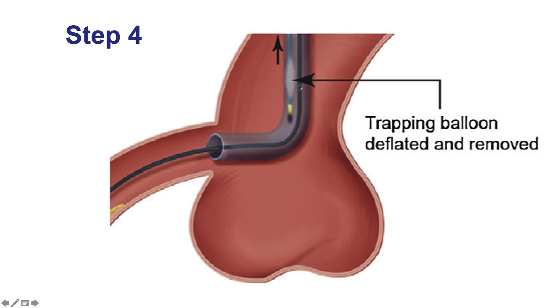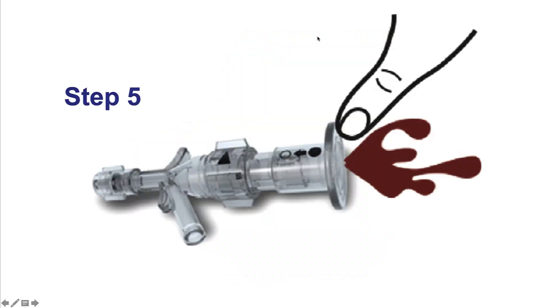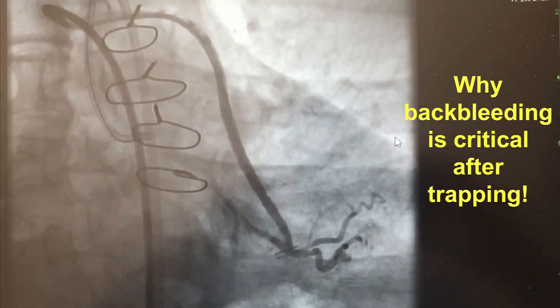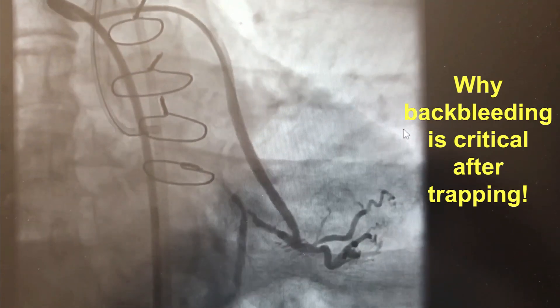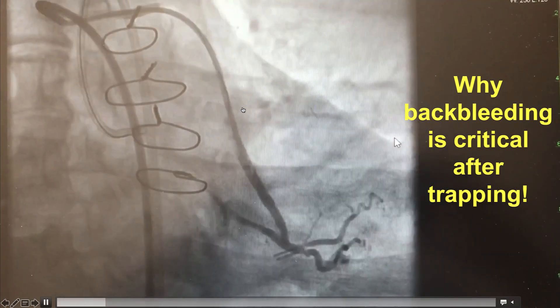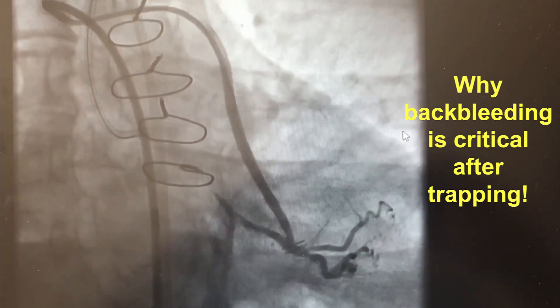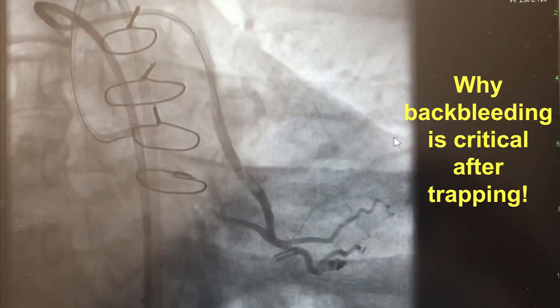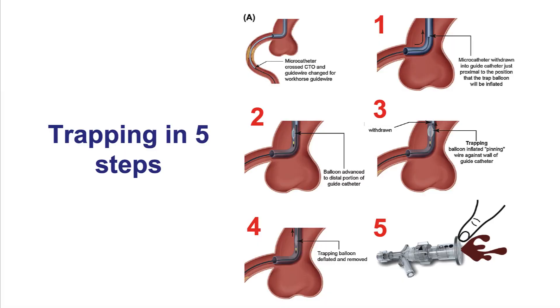Once the microcatheter is removed, the next step is to deflate the trapping balloon and remove it. The final step is to back bleed the introducer — this is critical because during trapping, air can and usually does come inside the guide catheter. If the guide and introducer are not carefully managed, sometimes massive air embolization can occur, as happened in this particular patient. I typically use a hemostat next to the guide to help tap the guide catheter and introducer and ensure back bleeding so all the air is evacuated. The trapping technique is the preferred technique for removing equipment, but sometimes it's not feasible — for example, when using bulky equipment through 6 French guide catheters.